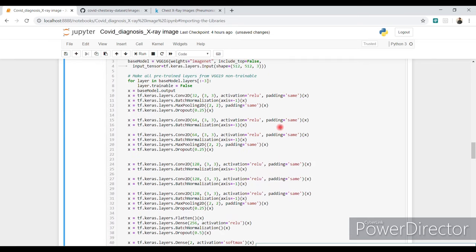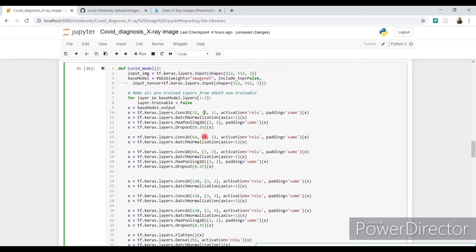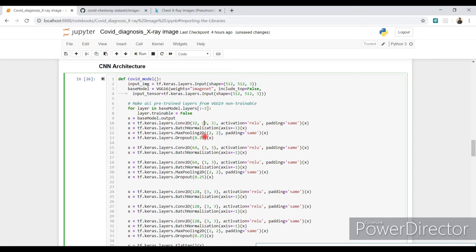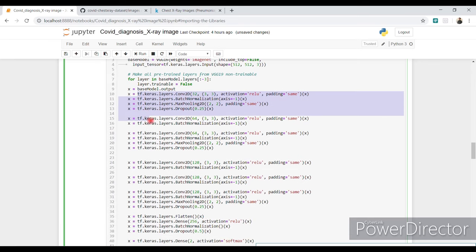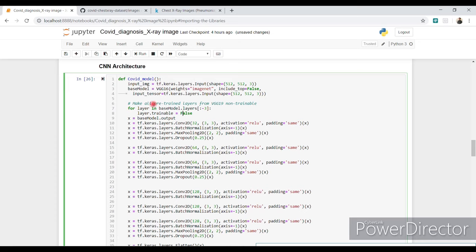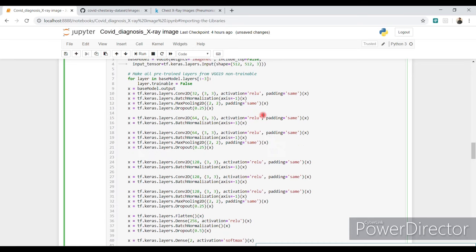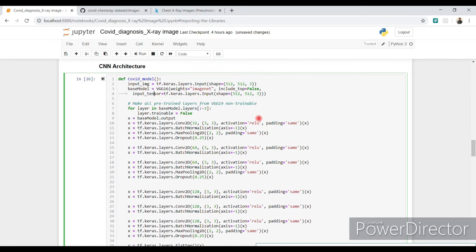Here is the heart of the deep learning — the CNN architecture. We use a VGG16 model. If you're a beginner making a simpler model it will be less accurate, because the more Conv2D, BatchNormalization, MaxPooling, and Dropout layers you add, the higher your accuracy. Run this model definition — if you're a beginner you may not understand every part, but I'll cover it in future lectures.